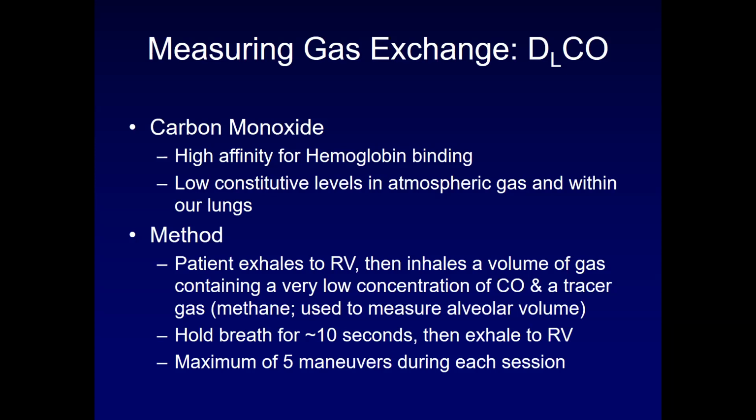The maximum amount of maneuvers that you want to do for each session is approximately 5. You start to see accuracy issues when the maneuver number exceeds 5.